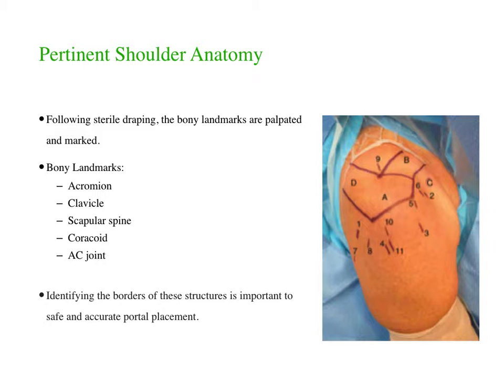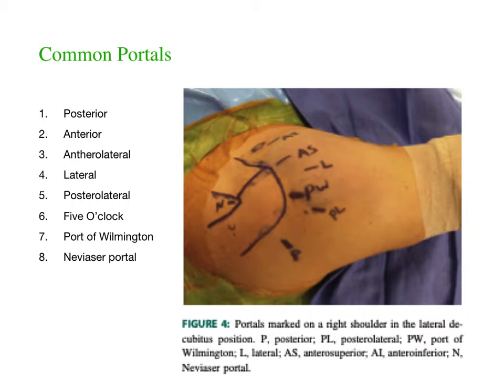Portal placement is the same for both the lateral decubitus and the beach chair positions. Some of the common portals are illustrated here in this drawing. Most commonly, the anterior and posterior portals are used.